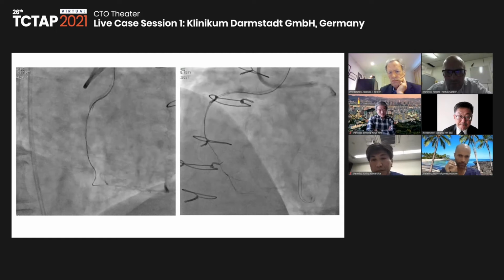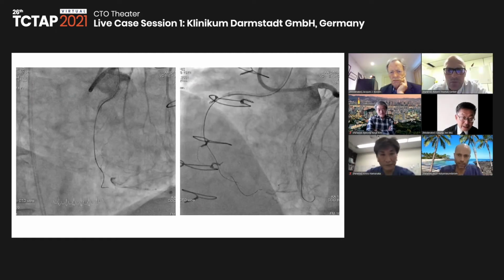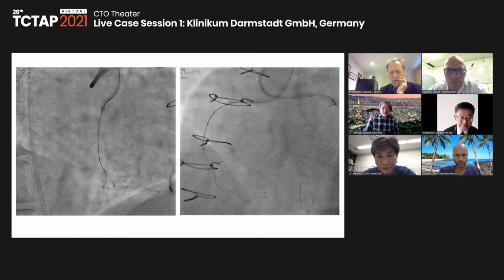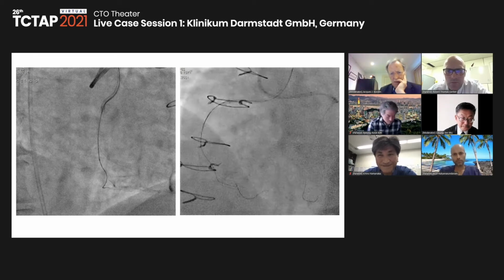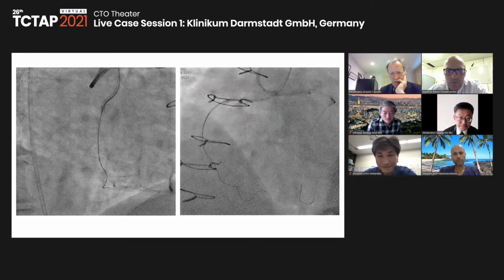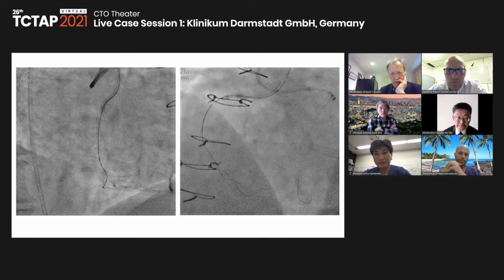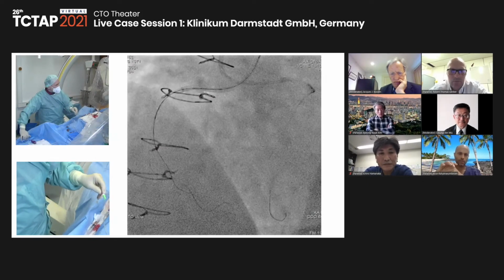I think we are on course. We're still far away, 10, 15 millimeters. It looks like on course. If I get closer, and I don't have the ambition to enter, but at least I can mark. Yeah, there is some resistance now. So I will try to get the Fine Cross a little bit further down.